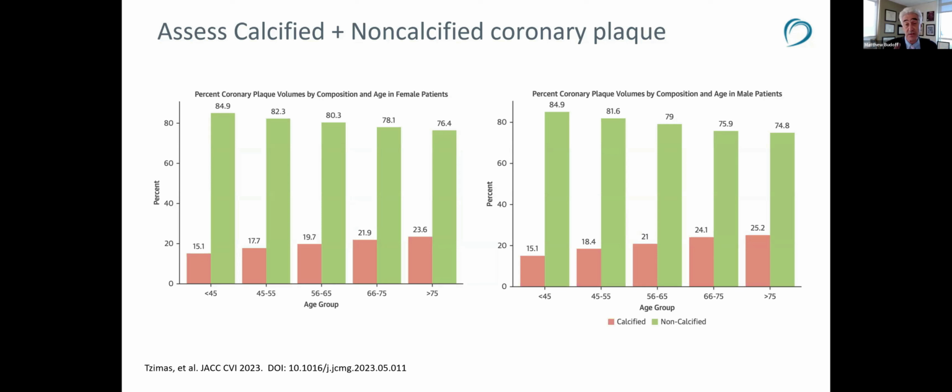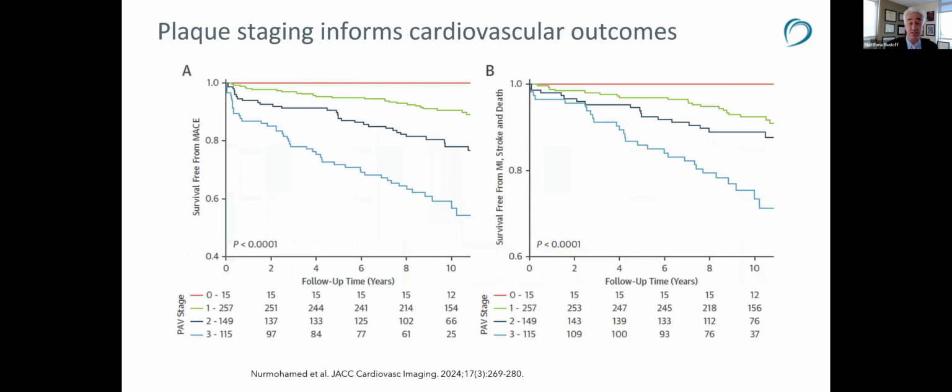Another advantage is we can use this tool to follow patients over time with quantitative plaque, where of course coronary calcium is not the best surrogate to follow over time given its unusual association with statins and increasing calcification with statin therapy.